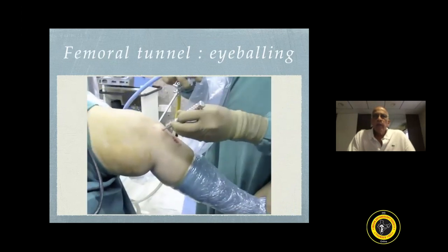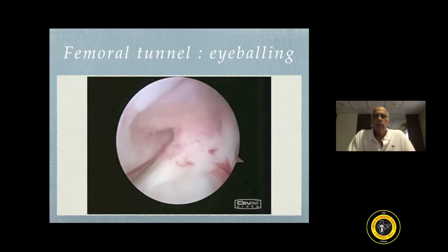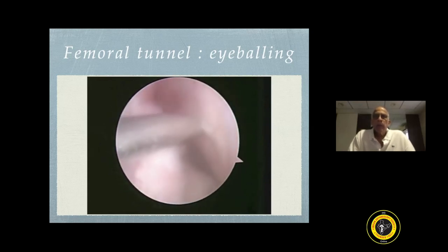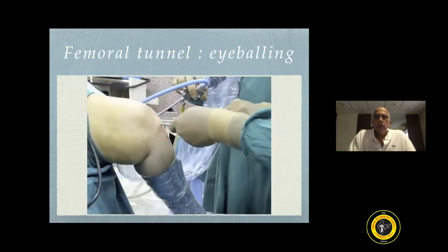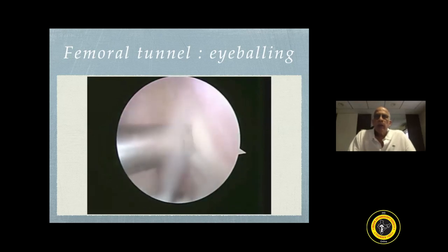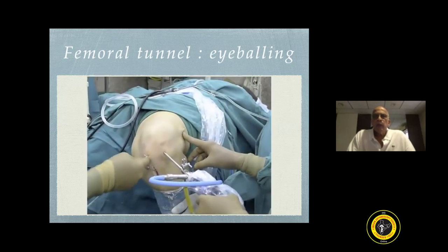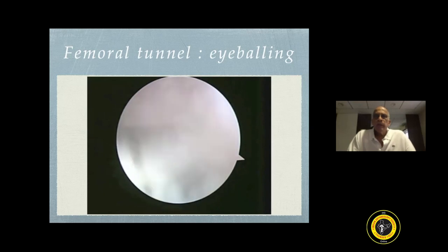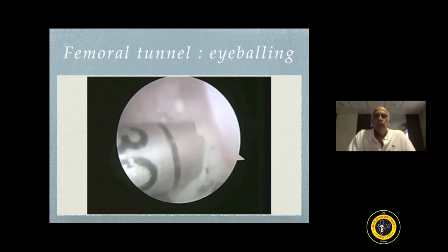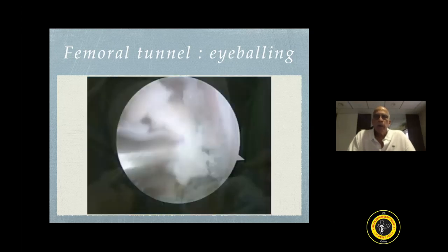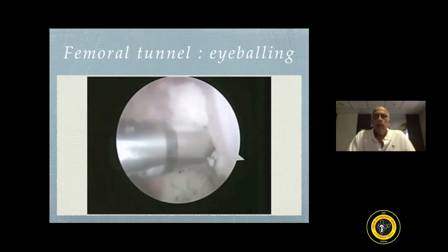Here are different ways by which you can create these oblique femoral tunnels. If you do not have instrumentation, you can do it by eyeballing. Here you can see we have passed an awl, located the femoral footprint, and made a perforation at the anatomic site. We then replace the awl with a bead pin directed towards the anterolateral aspect of the thigh. You can see the penetration of this bead pin at the lateral cortex. Once you are happy with the positioning, you can dilate with the appropriate size reamers and then with a 4.5 reamer if you are going to use any kind of distal fixation devices like an endo button. This is how you can drill the femoral tunnel by eyeballing.